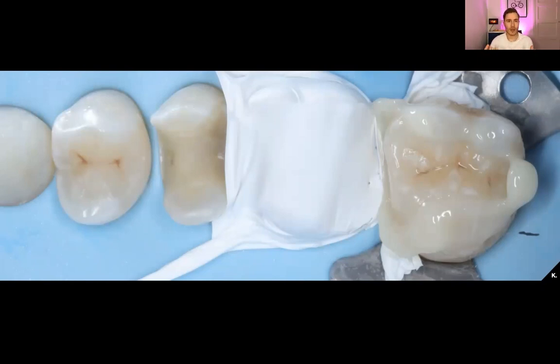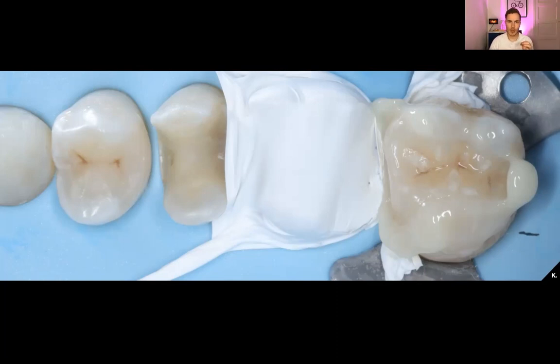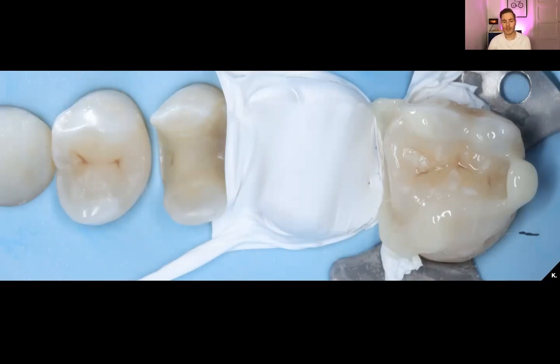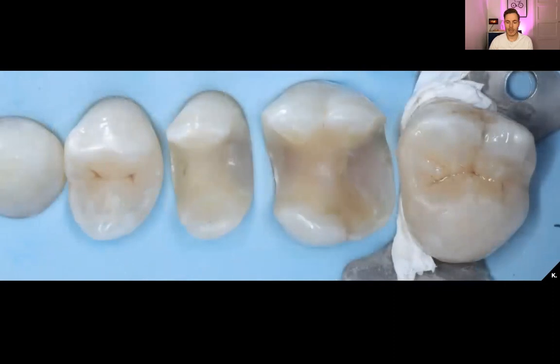You can see there's a lot of excess composite. I use heated HFO-UD2 by Mycerium — it's a really nice composite with thixotropic characteristics, which means if you put some pressure it becomes quite liquid, and if you let it set it becomes more stiff and easier to remove. By using this I can get a really nice blend between my restoration and my tooth and a really good bond strength. I can remove the excess with all kinds of instruments — micro brushes, other brushes — and then after light curing it looks like this.